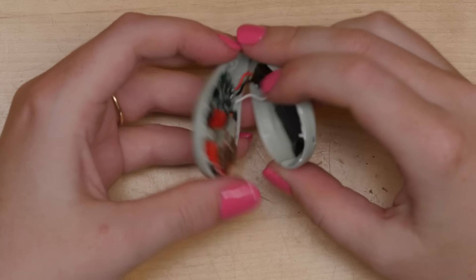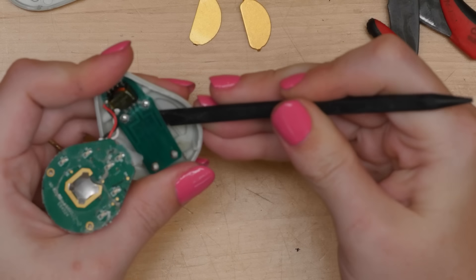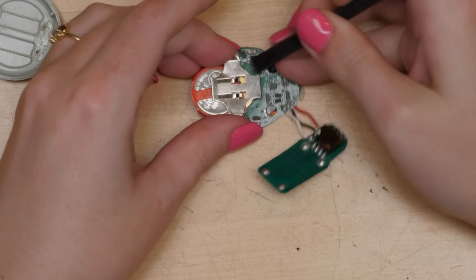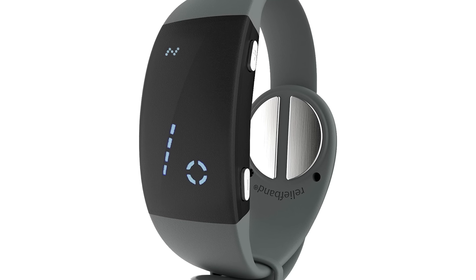To take this gadget apart, I used leverage to pop the two halves of the enclosure apart. As suspected, it is possible to replace the coin cell batteries inside when they die, then snap the enclosure back together. They wanted to offer a more affordable SKU than their rechargeable models, some of which also have a screen.